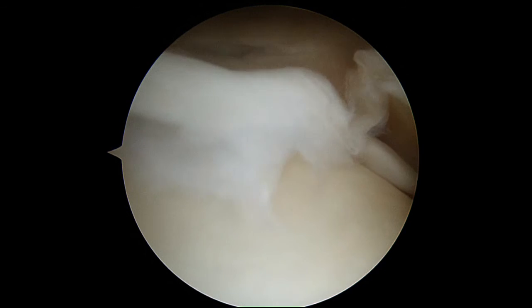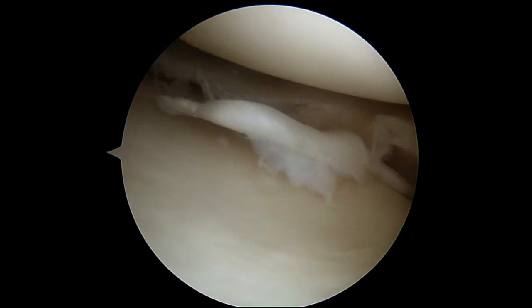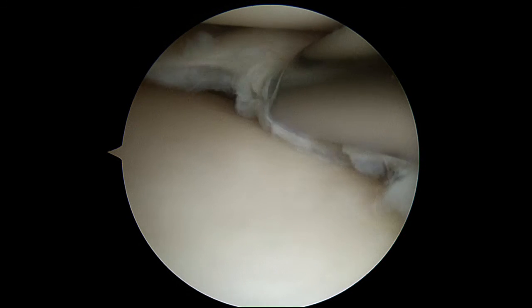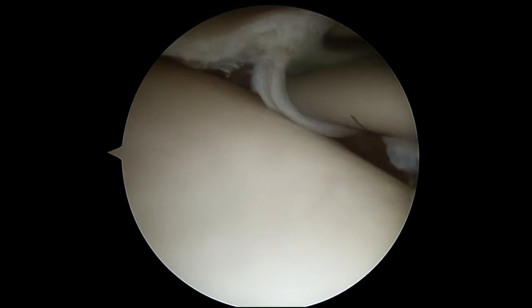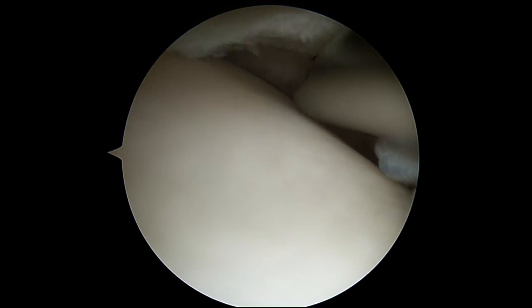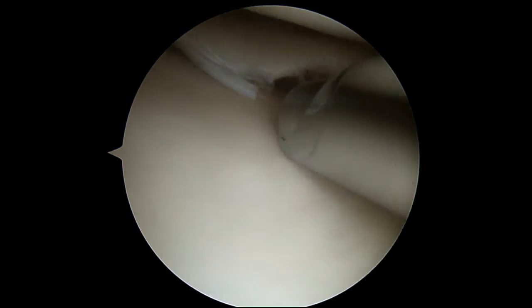We'll just clean that up. This is a little shaver that has suction attached to it — it takes the edges of the torn cartilage and removes them. There's that flap underneath — there it goes, it's gone now. Just a little bit more.